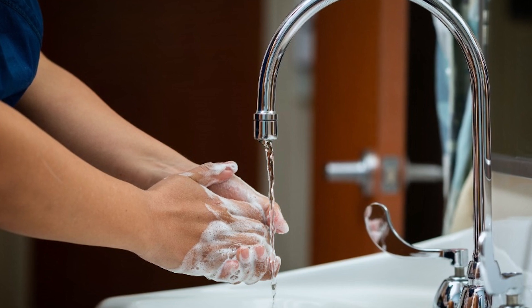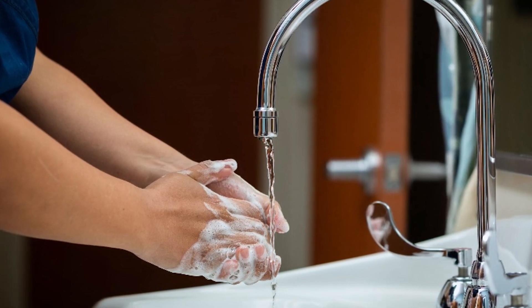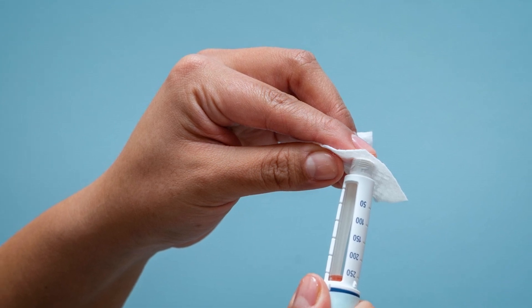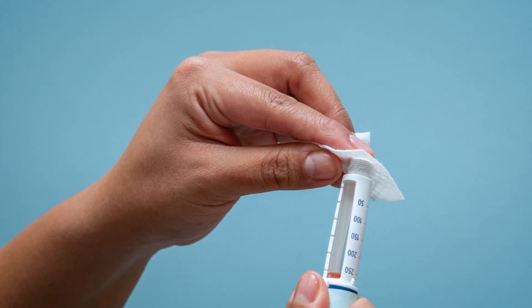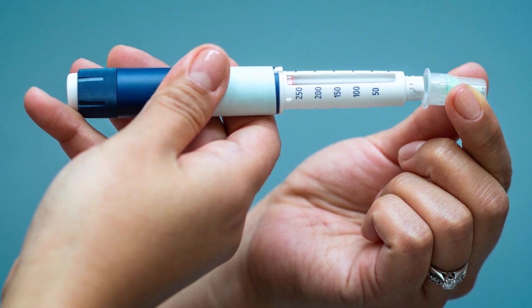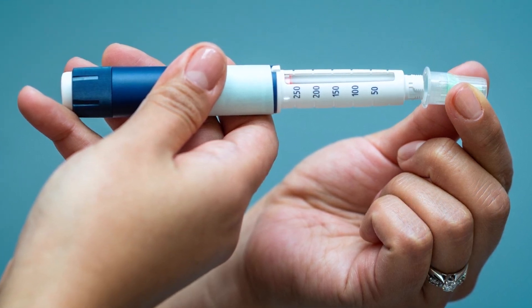Step 1: Wash your hands with soap and water and gather supplies. Step 2: Remove the pen cover and wipe the top with an alcohol pad. Step 3: Pull the paper seal off the pen needle and screw the pen needle onto the insulin pen.